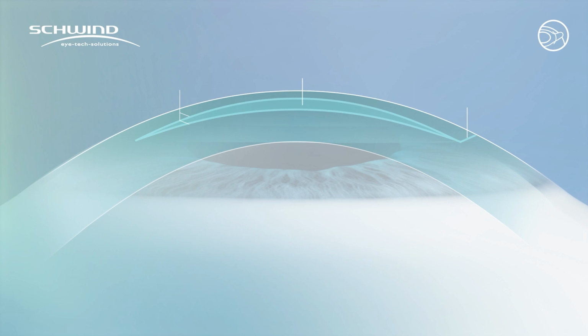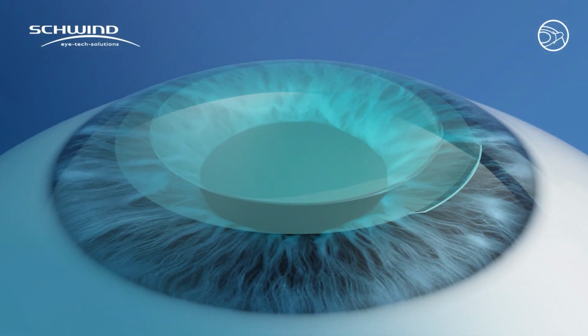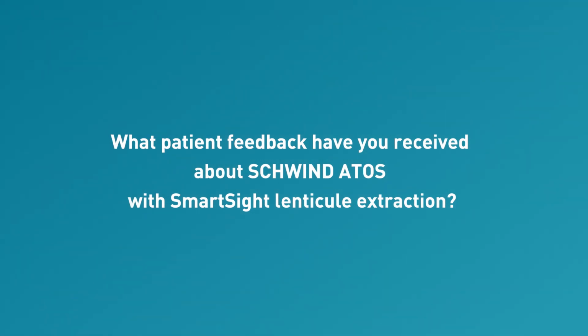I don't have patients complaining of night vision problems or quality of vision problems with SmartSight at all, because the effective optical zone is so much bigger. You don't have to work within a flap, you can do a big optical zone and overcome all of that. It's really blown us away.